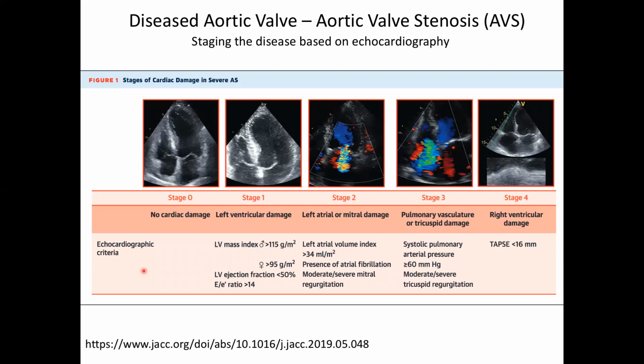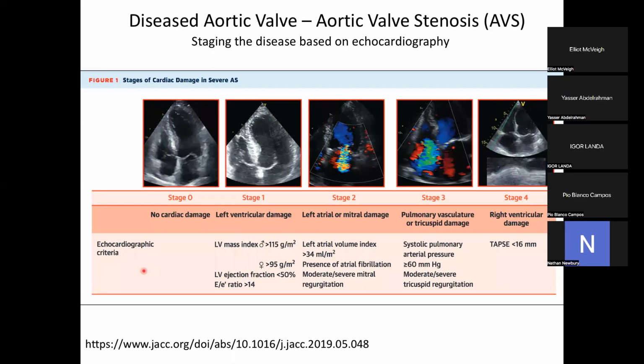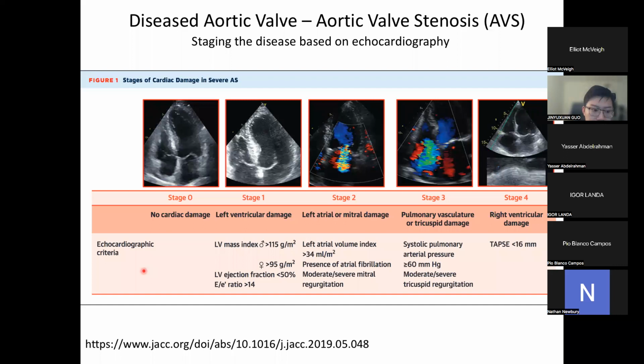As imaging gets better, the only thing that changes is the accuracy of your estimates of that physiology, not any fundamental thing that all of a sudden doesn't matter anymore because this machine has been replaced with a better one, right? So when you're engineering these machines, you're making better and better pictures, but you always are focused on what is the physiology that I can measure with superb accuracy and reproducibility, such that it can be used in making decisions, right?